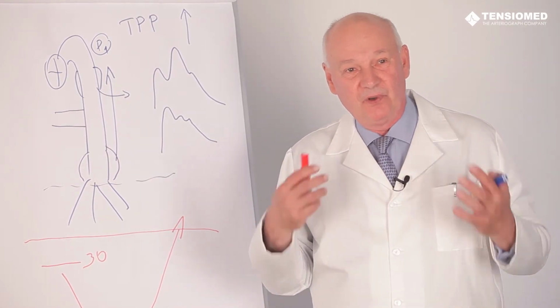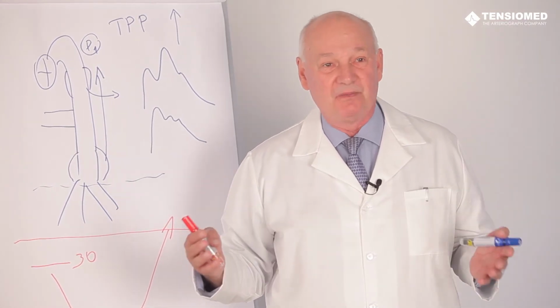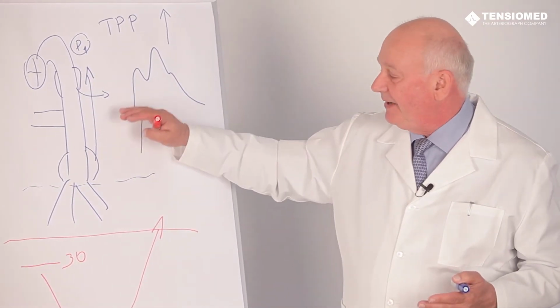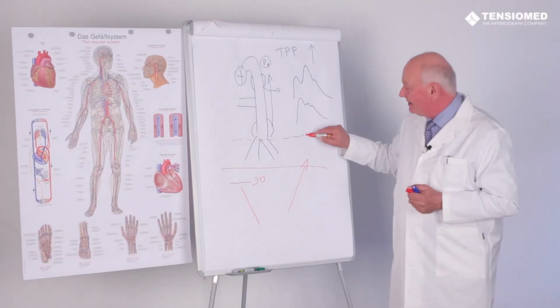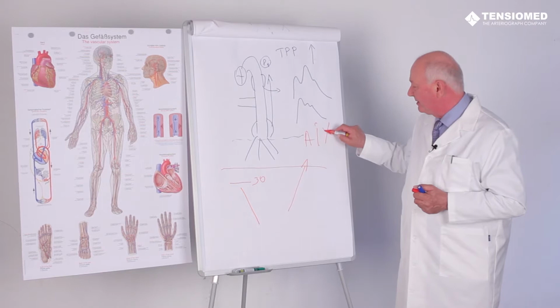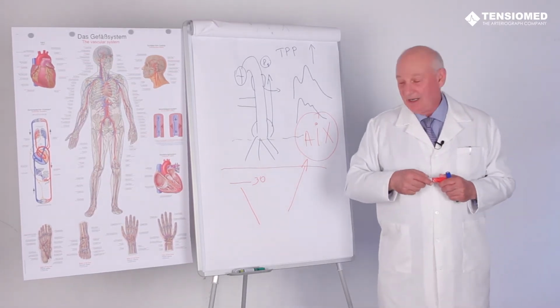Thus, if we follow this standardized procedure, which is more or less similar to blood pressure measurement, we can obtain a very nice parameter in the augmentation index, that is a nice marker of the actual peripheral vascular resistance.